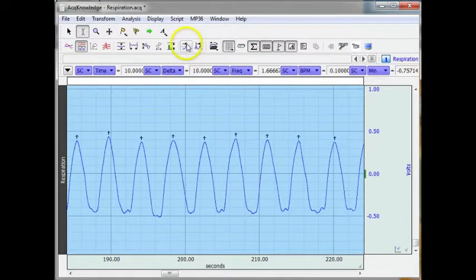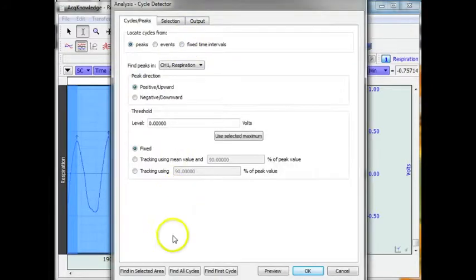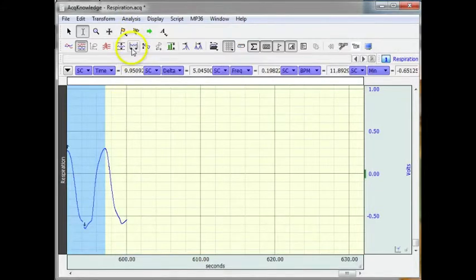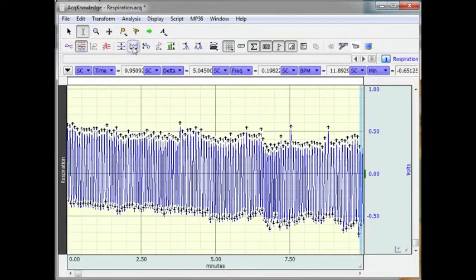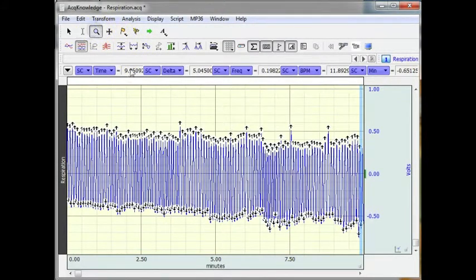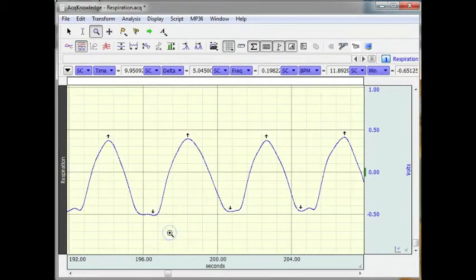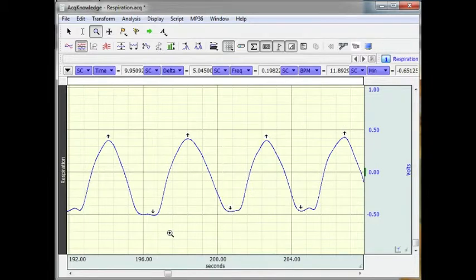And selecting all the data, I am going to hit find all cycles. And if we condense everything down, so now we have got event marks identifying both the peak and the minimum values.